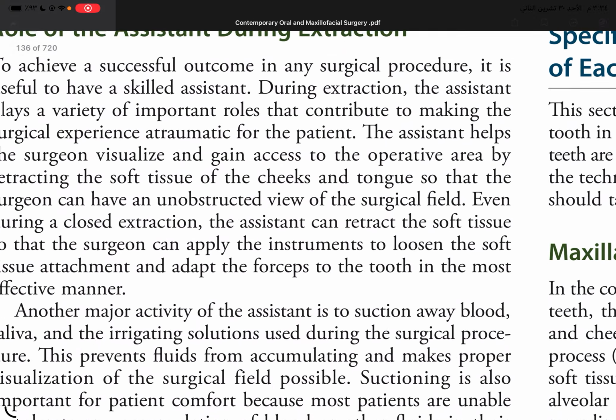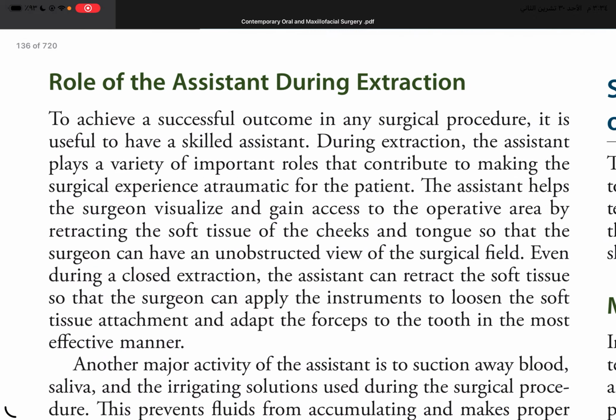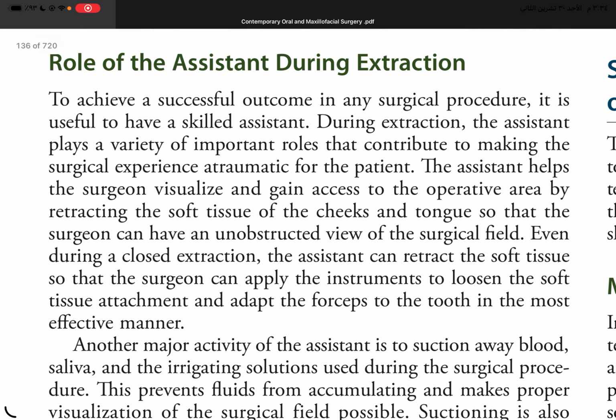Role of the assistant during extraction. To achieve a successful outcome in any surgical procedure, it is useful to have a skilled assistant during extraction. The assistant plays a variety of important roles that contribute to making the surgical experience atraumatic for the patient.